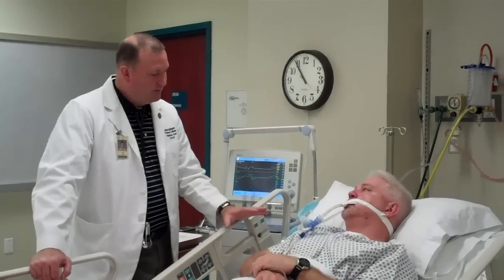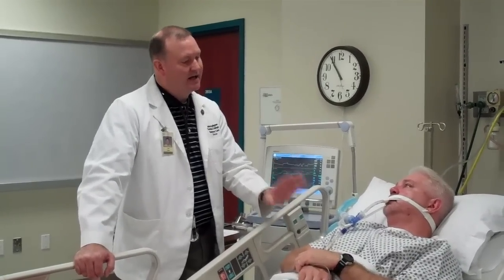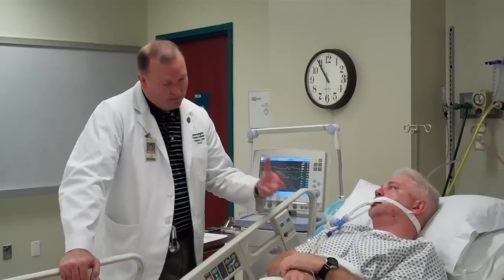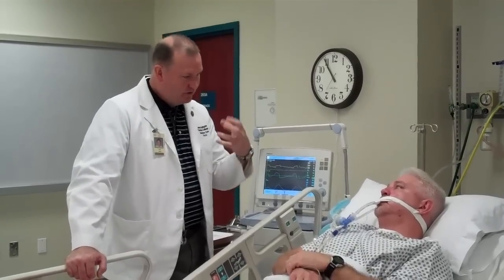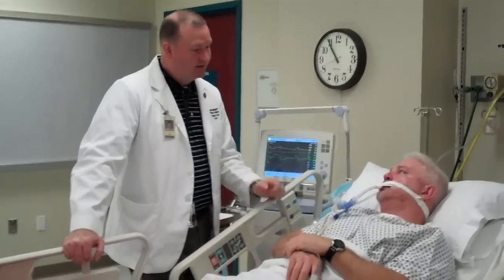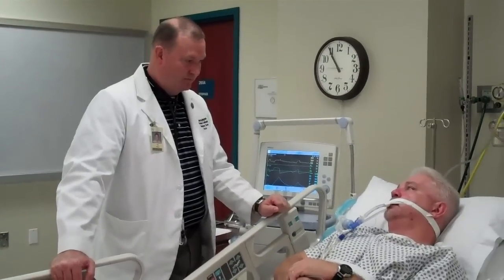So now what's going to happen is whenever I tell you to, we're going to do the test just like we did last time. When I tell you to, I want you to take a nice deep breath in as deep as you can, but whenever you start pulling in, you're going to feel like you can't get any air — just keep pulling as hard as you can. At some point, you're going to feel like you can get that air in and then you're going to get that breath.